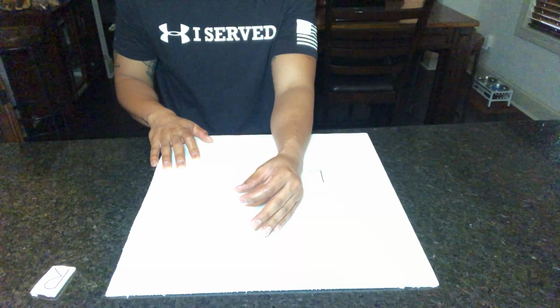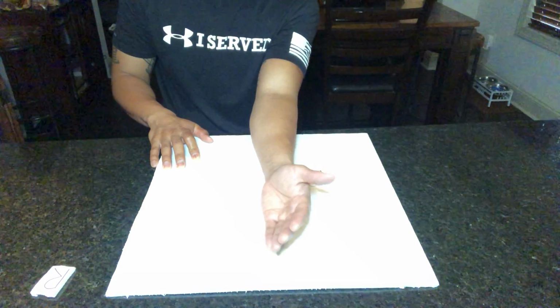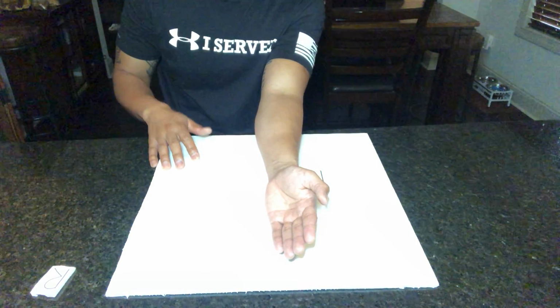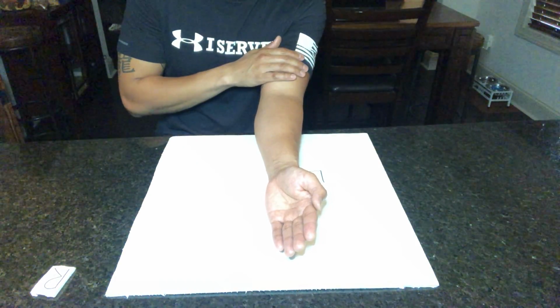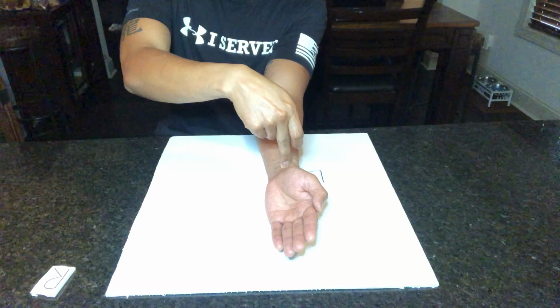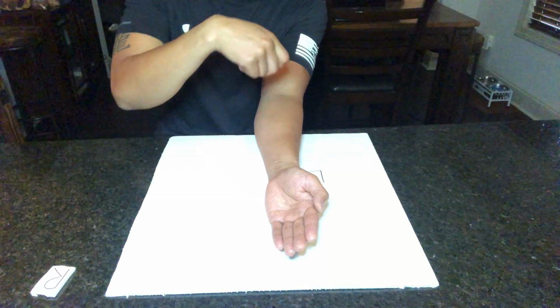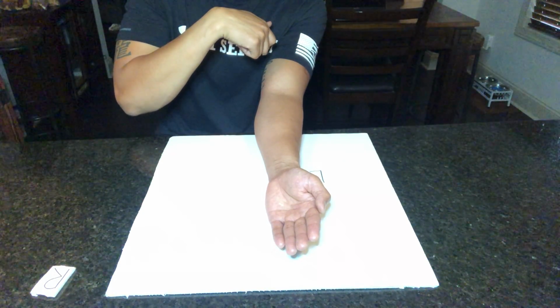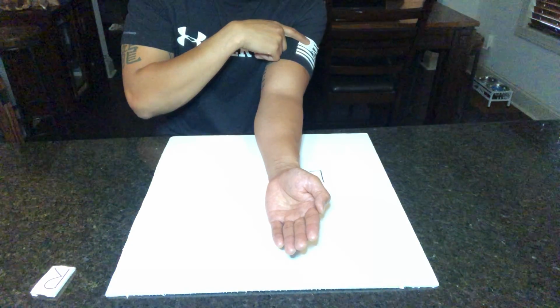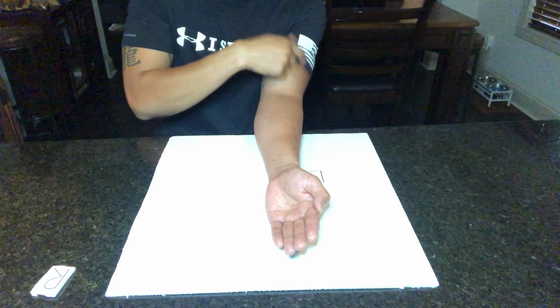Next is the lateral oblique wrist view. Have the patient bring the hand, flip over, but not completely supinate, kind of at an angle here. 40 SID, cassette 10 by 12. Central ray is going to be perpendicular to enter at the end of the distal radius. And in this particular view, we're looking at the pisiform specifically. Again, ask the patient, don't breathe, don't move. Reduce collimation to reduce OID, and include shielding to protect from radiation.